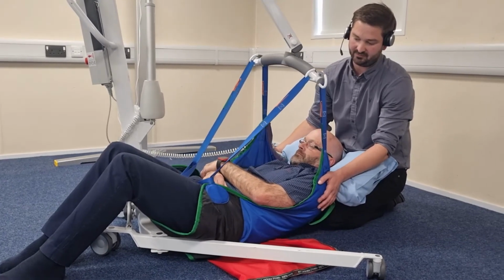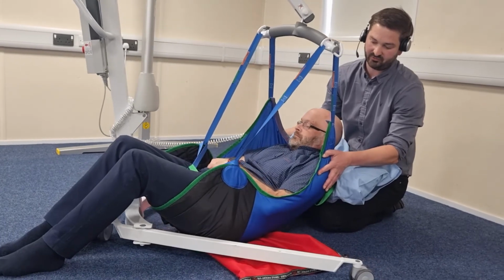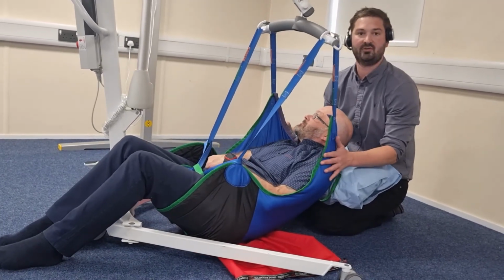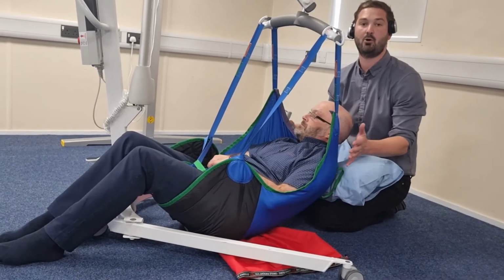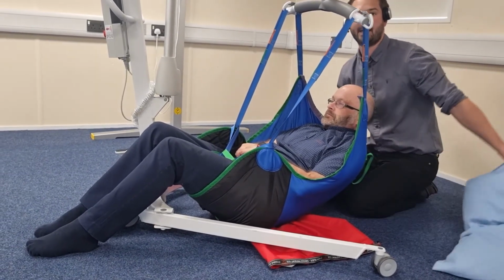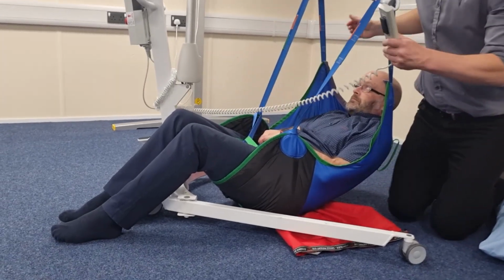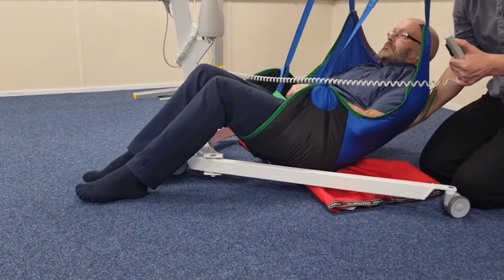So what you're going to see is the slide sheet come into use now. Once the sling has taken hold of the person and is now supporting them, it means that I can move out from behind them, because the sling is supporting behind. I'm coming to the side. I'm just going to bring them a little bit further up.